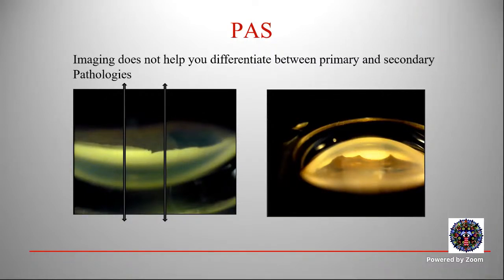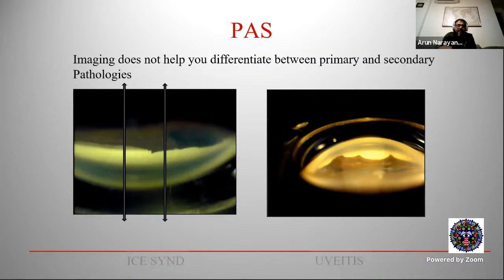Right. So I would say this is a non-indented view of an angle. There are simultaneous areas of open angle and synechial closure. So this is most likely a secondary closure, and you put the clinical things together.